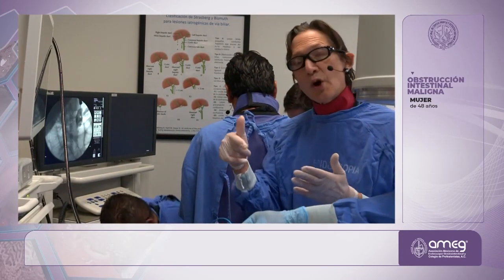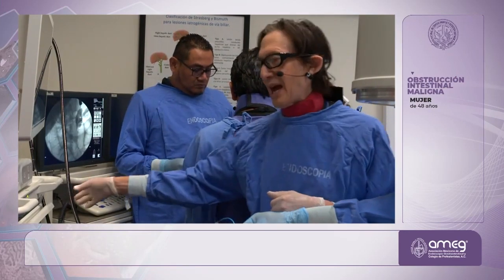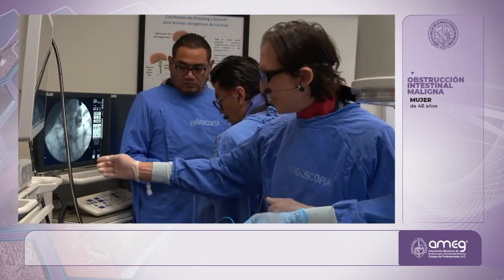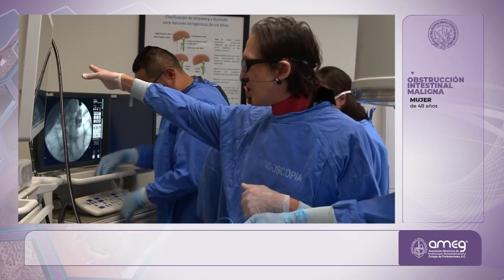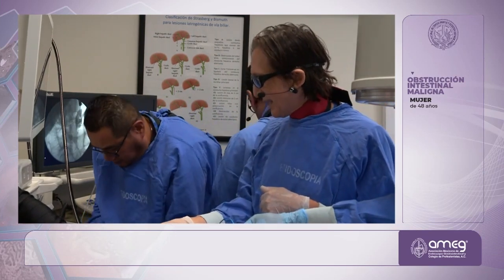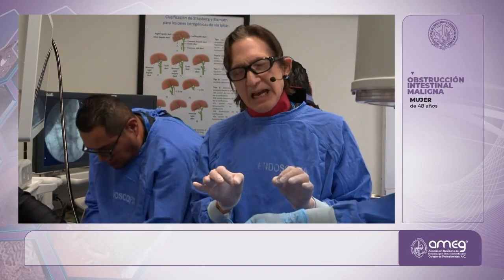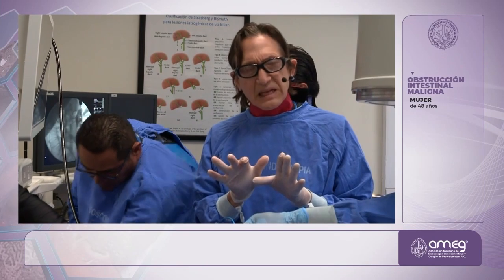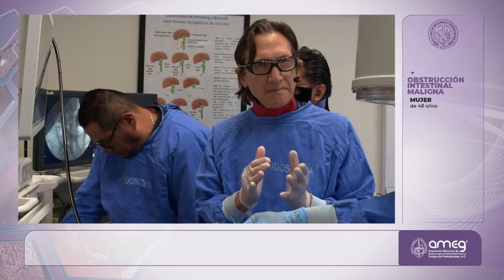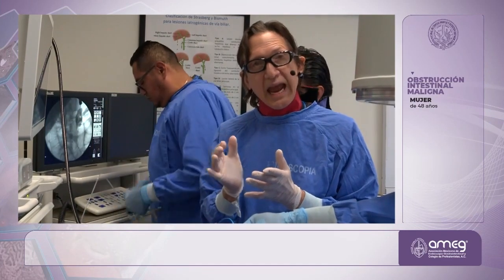Okay, now I'm going to go alongside the OEC, the oral enteric catheter, with my therapeutic echoendoscope and perform my GE. So now if someone can just pass me the echoendoscope. Sergio here, he's busy at work. He's going to switch out the scopes. And when I go in alongside, what you want to be very careful is that you don't push down too far. The gastroenterostomy is going to be created between the proximal body, the posterior wall, and the ligament of Treitz.